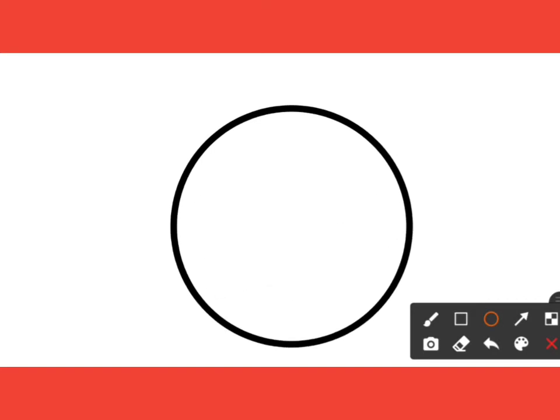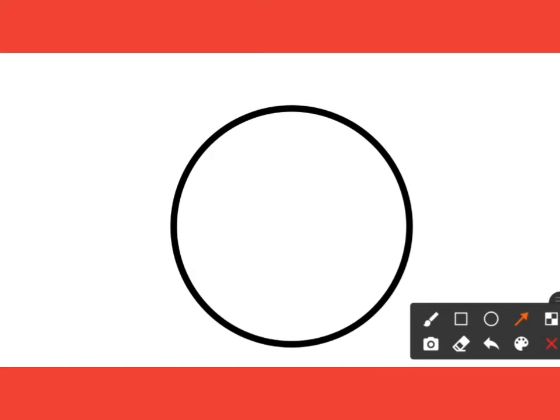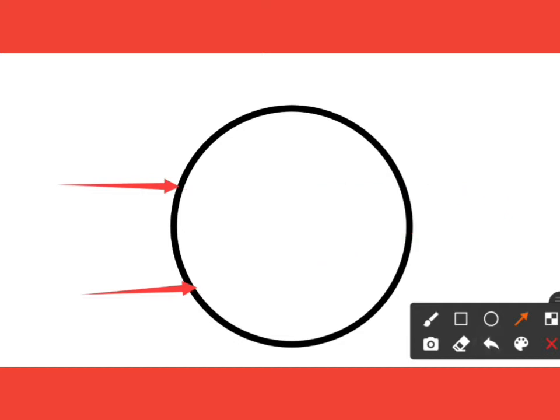In a myopic patient, from the definition, light rays are focused in front of the retina, but the red wavelength is longer than green. In an emmetropic patient, the red wavelength is focused behind the retina, but in a myopic patient, this red wavelength will be focused on the retina. So it shifted from backward to forward. Let's draw this line nicely.